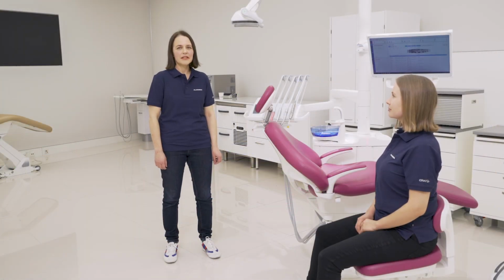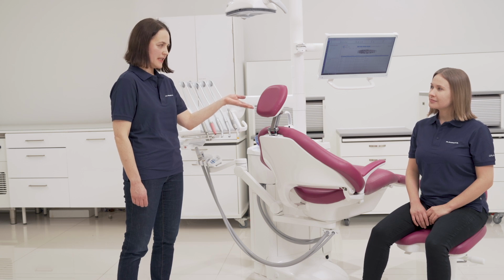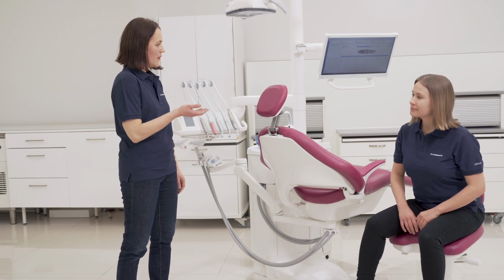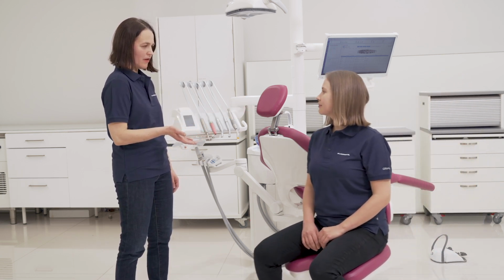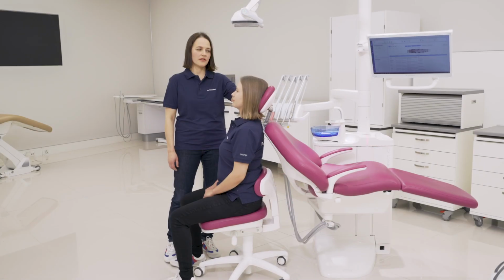If you sometimes face a situation where you have to treat a patient in a wheelchair, you can adjust the headrest like this. Then the patient can enter in a wheelchair and get support from the patient chair headrest.